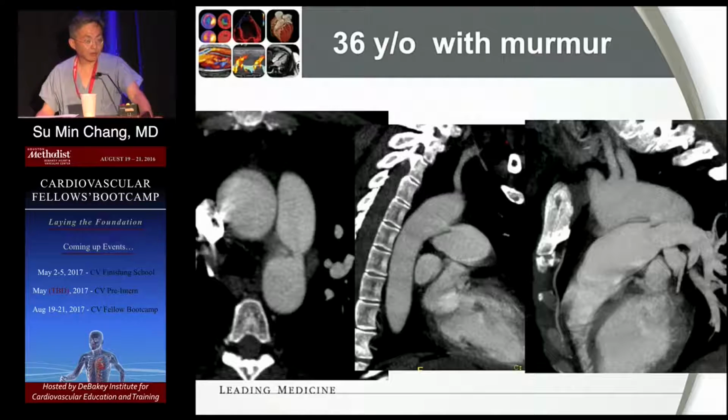All right, Omar, you want to give a shot at this one? A 36-year-old with a long-standing history of murmur. So this is the ascending aorta, descending aorta, so it's a cross-section. And this is the PA. Basically, they're giving away the diagnosis. PDA, okay. You usually see in the echo just a little color flow going through. Actually, you're seeing it right now, okay?